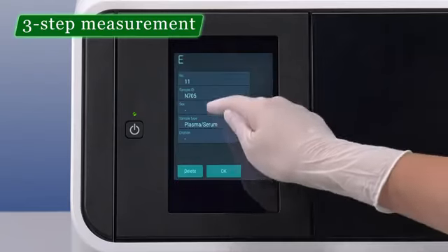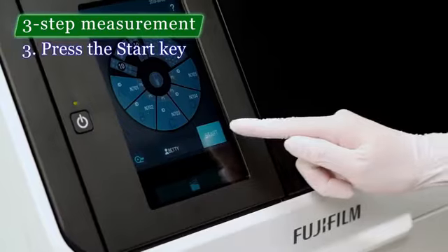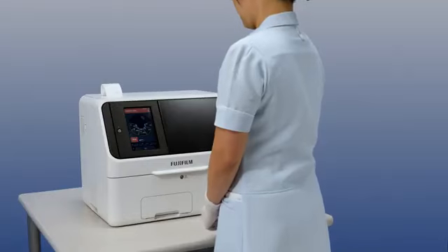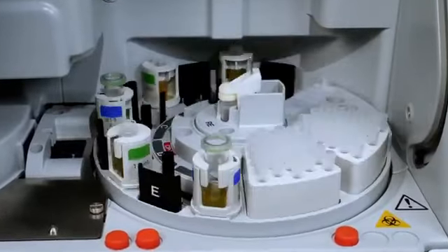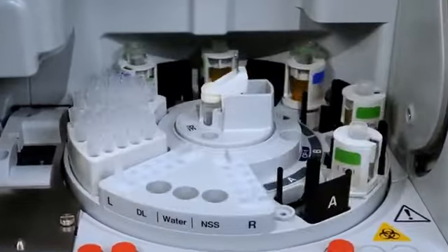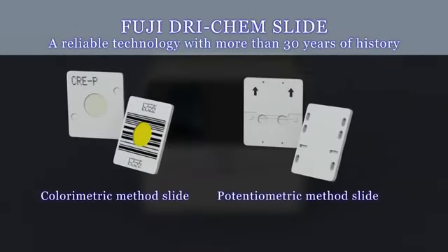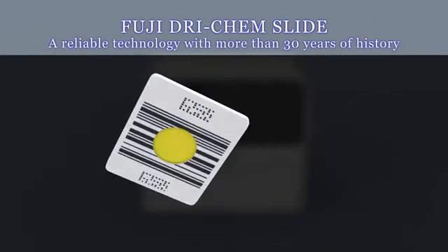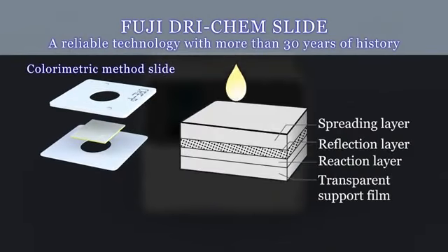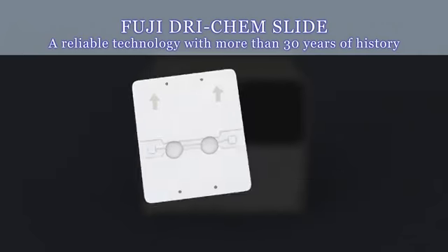Dry chemistry analyzers are compact and easy to operate, as these do not require storage space for reagents. There is no need for pipetting of reagents, and these are semi to fully automatic and require small volumes of samples. These factors have contributed to high adoption of dry chemistry analyzers in acute care settings, physician offices, etc. Dry chemistry analyzers such as blood glucose analyzers, blood cholesterol analyzers, and blood electrolyte analyzers have been widely used across the globe. There are a large number of dry chemistry analyzer manufacturers in the market.